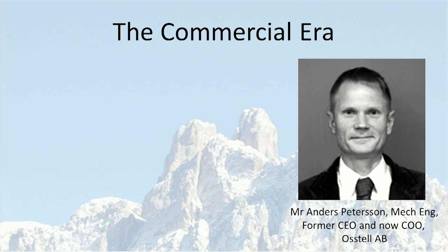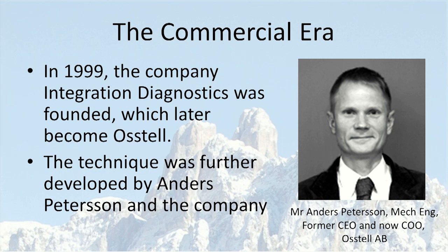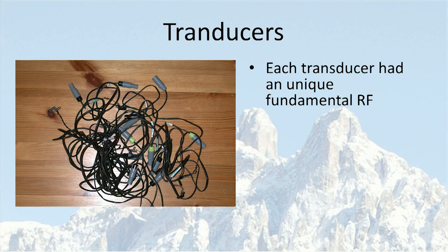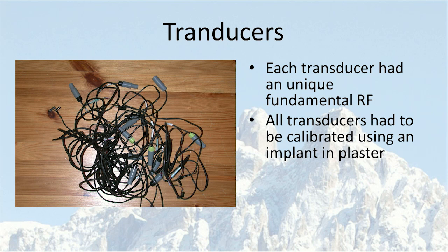And Anders has been instrumental, I would say, for the further development of the technique. And what we realized during the first era, using the first and second generation, was the problem with the transducers. Each transducer had its own fundamental and unique resonance frequency. So this meant that we had to calibrate each transducer. And then after the measurements, we have to add or retract hertz in order to calibrate all the transducers.